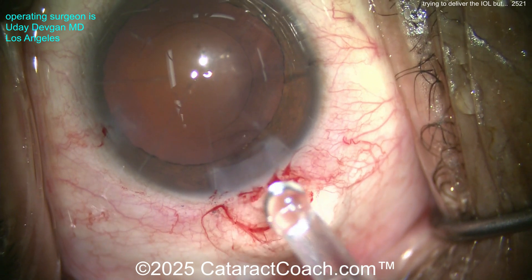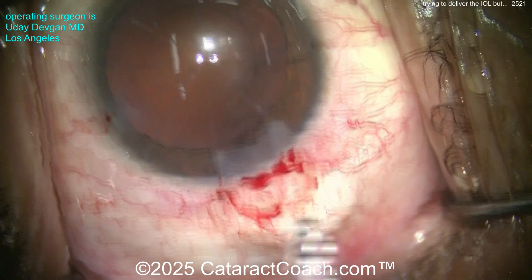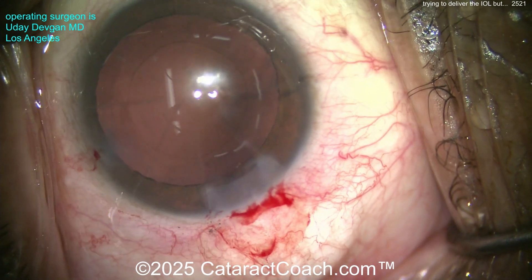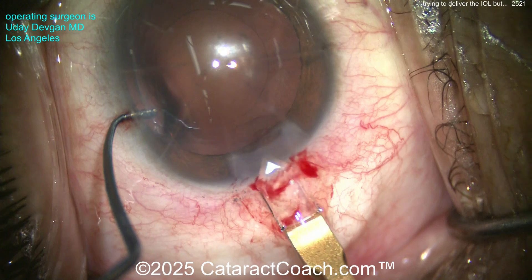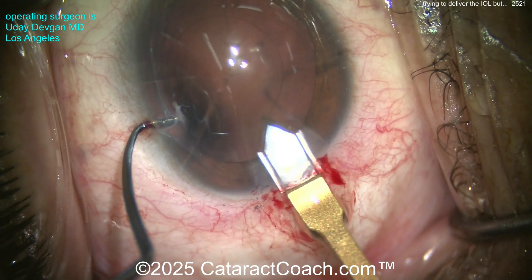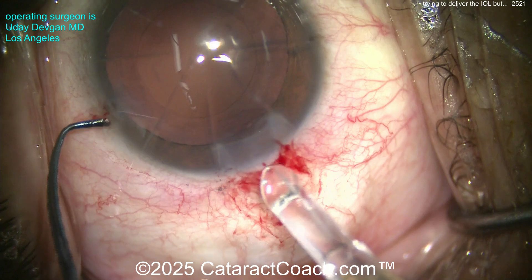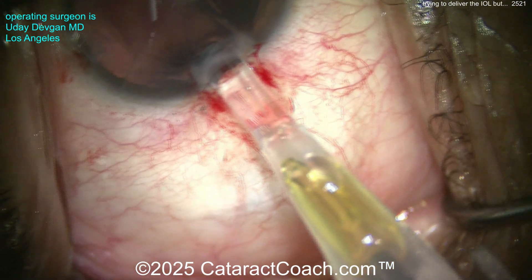Before we try to put it in the eye again, I say let's just enlarge the incision slightly. We'll get the diamond keratome and carefully avoid touching the RK cuts — just go in one direction, very slightly. I don't need much, just a tiny bit more. Again, you don't want to intersect the RK cuts at all, because those will rip right open.